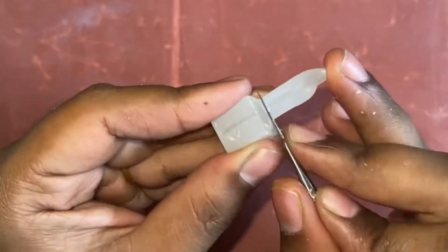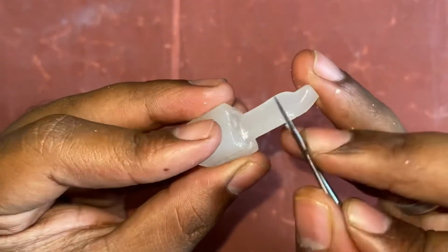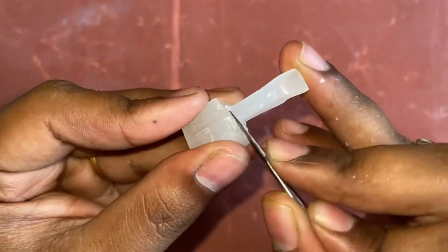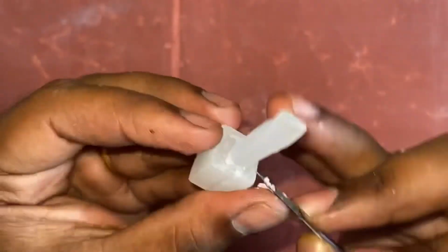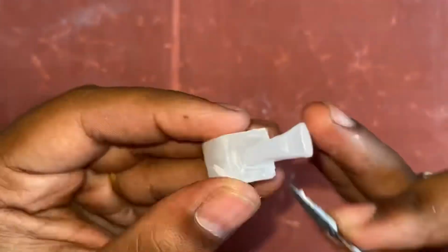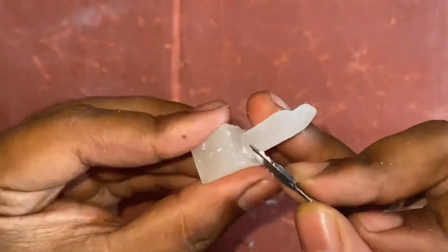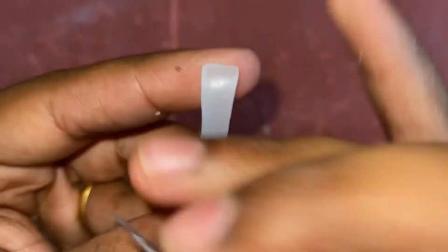Now here we can appreciate the tapering of the root towards the apical aspect. So polish it and then gently scrape out the wax. Scrape out the wax from the base so that it is more prominent. The root is appearing more prominent.